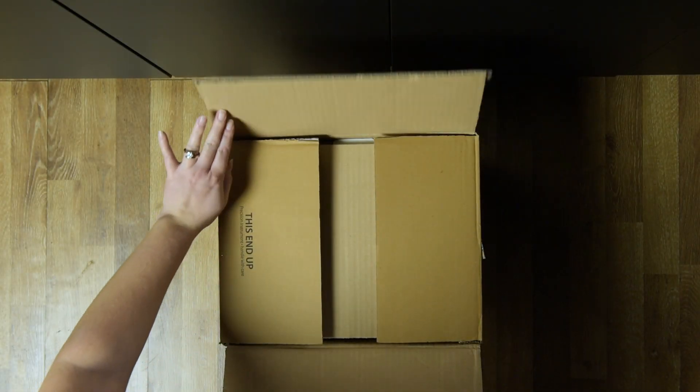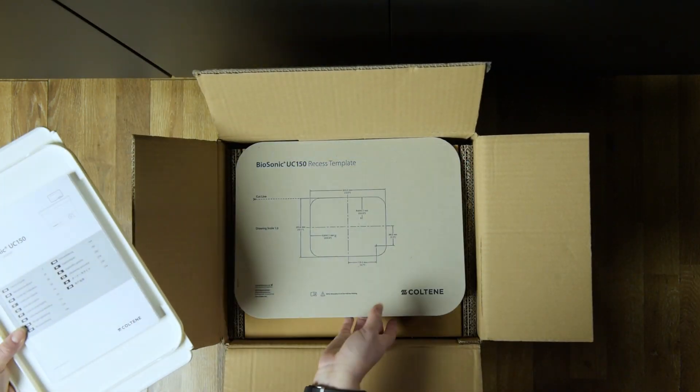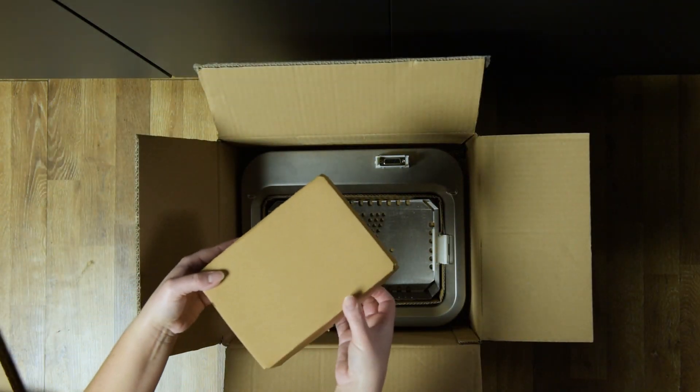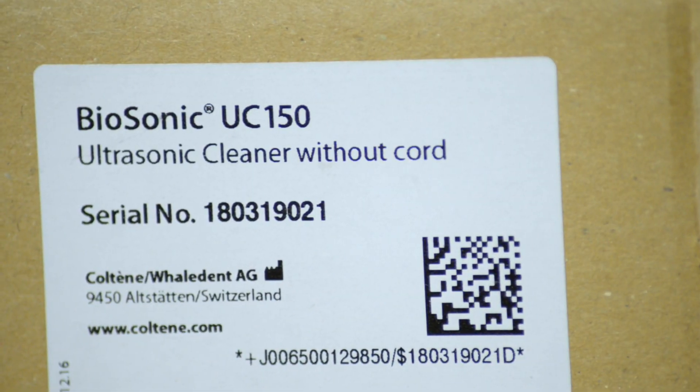Remove your cleaner from the shipping container and inspect the unit for any possible damage which may have occurred during shipping. Check the serial number found on either the underside or rear of the unit with the number on the shipping carton. If they're not identical, contact your dealer.